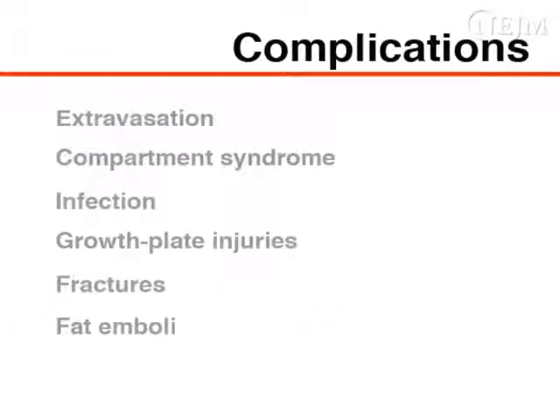Serious complications associated with intraosseous cannulation are rare. Extravasation can occur following inadvertent infusion of fluid into the soft tissue surrounding the targeted bone or beneath the periosteum. Prolonged extravasation can lead to compartment syndrome. To decrease this risk, perform serial examinations for swelling and remove intraosseous catheters once further vascular access is obtained, ideally within 24 hours.